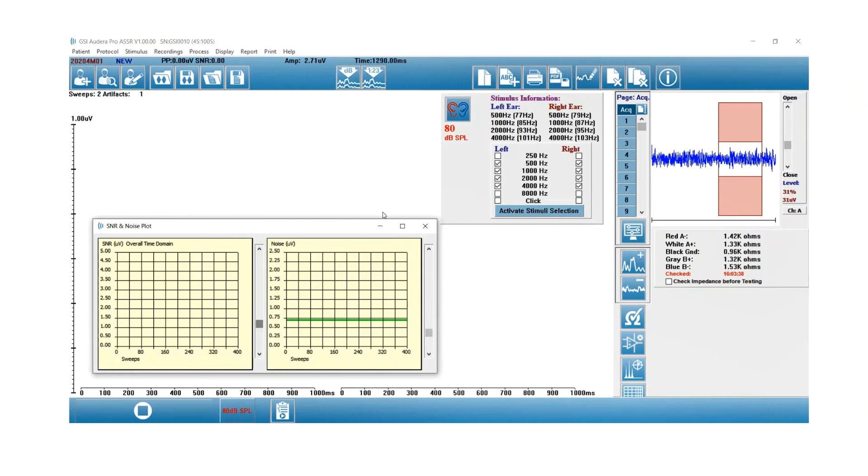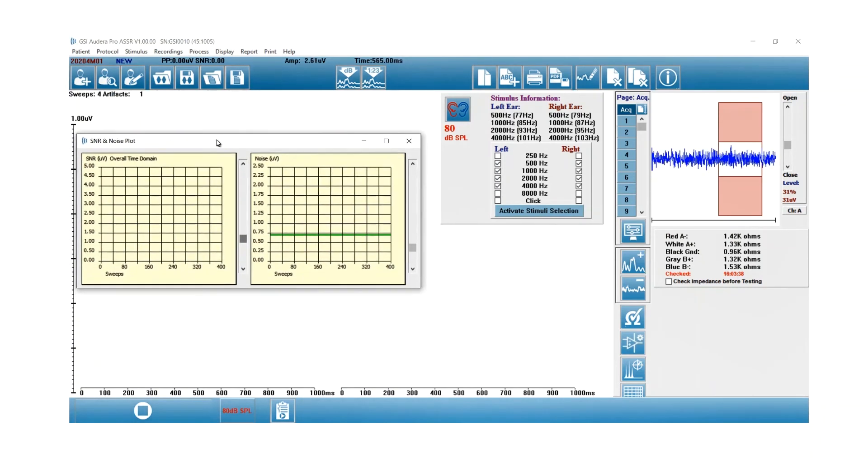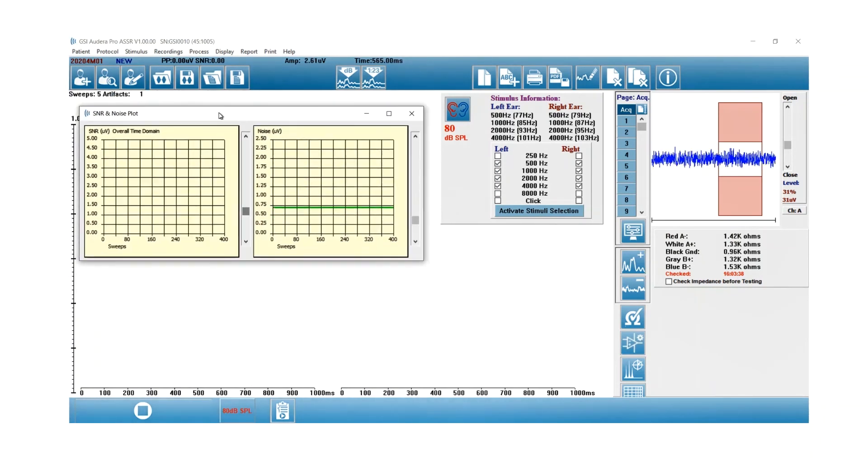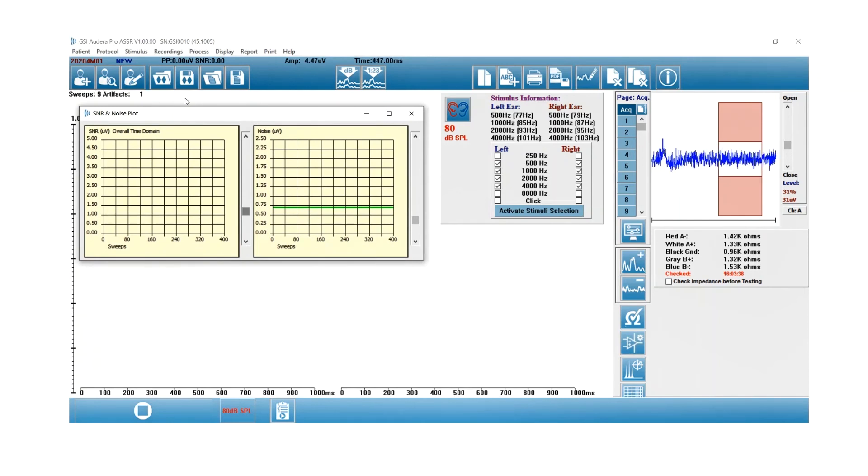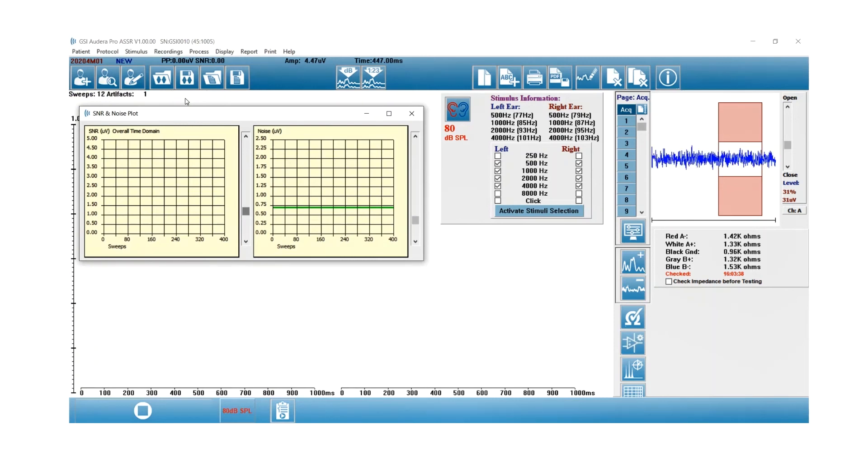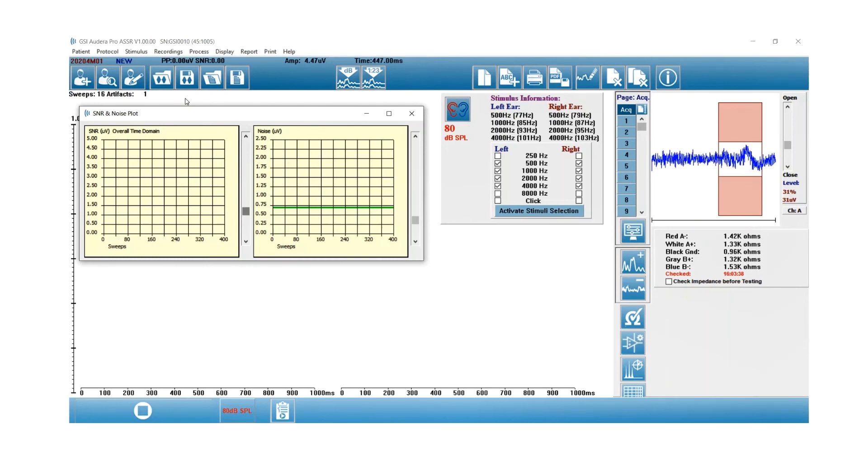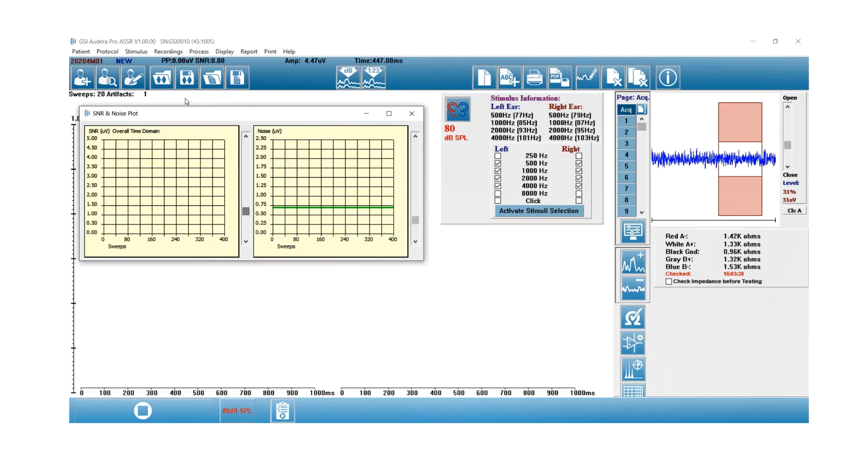As soon as you start a test, I started both ears, the SNR and noise plot window is going to appear. You can see in the upper left corner the number of sweeps, so I'm not seeing any test data yet on my screen until I reach 20 sweeps. As soon as I reach 20, you'll see waveforms appear and you'll see plots on the SNR and noise graphs.